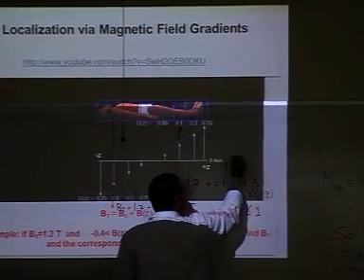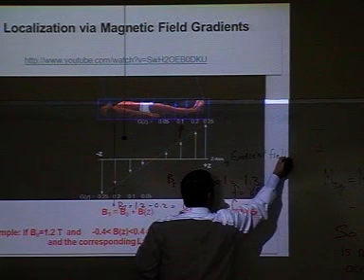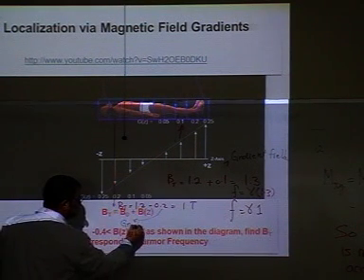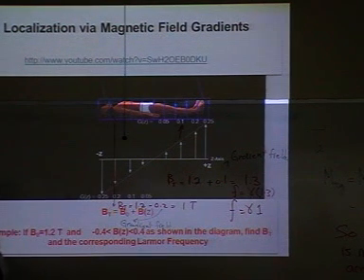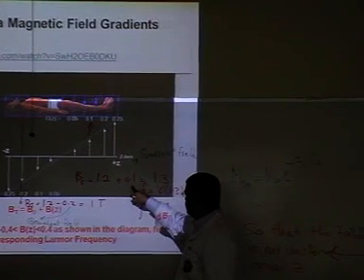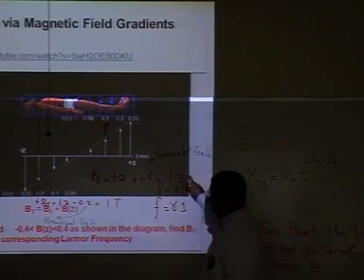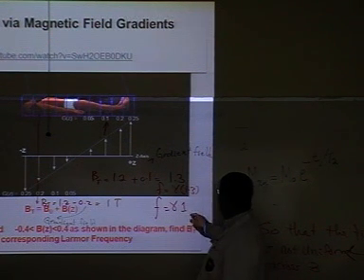That's my gradient field, by the way. This is gradient field, and so is this one. So the gradient field means what? It varies as you go across the patient. So when I'm here, my total magnetic field is equal to 1.2 plus 0.1. That means 1.3. When I want to select, my resonance frequency will be this gamma multiplied by 1.3.